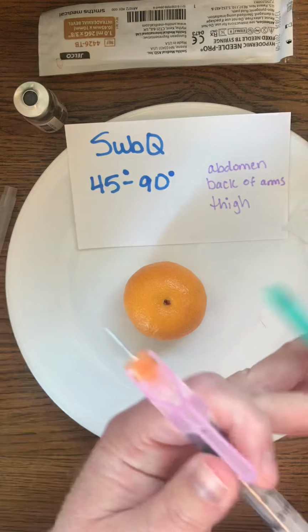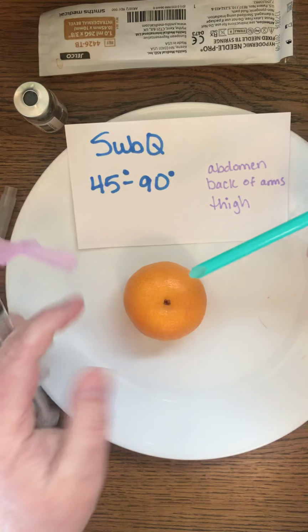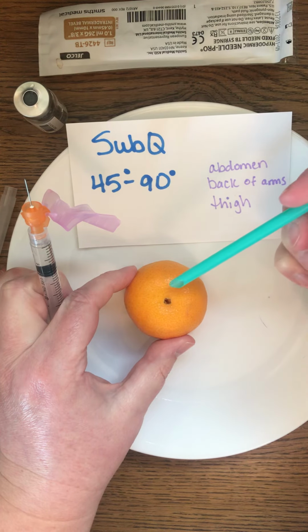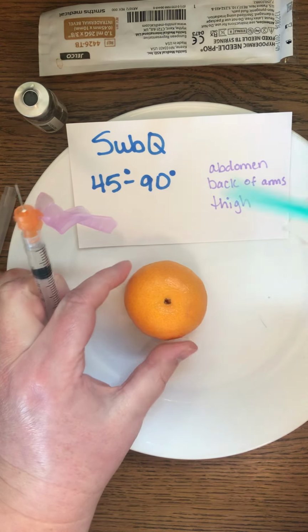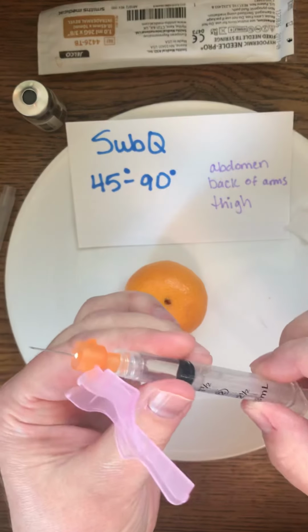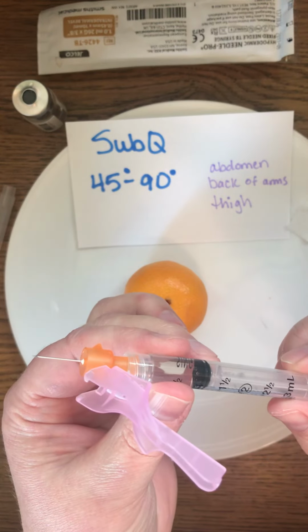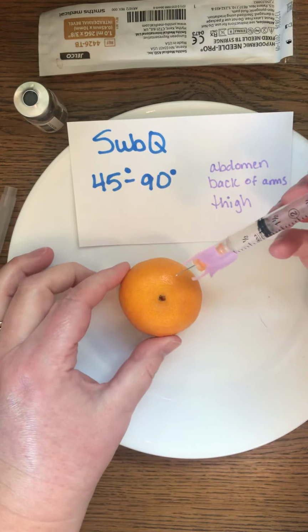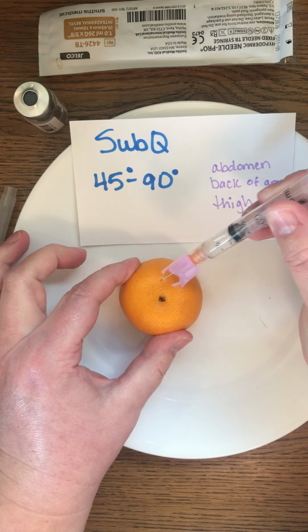So again, to give you an idea of how I'm holding this, I'm going to hold it like this, so you can see my bevel there. So then that part goes into the skin first and pierces the skin. When you're doing a 90-degree angle, it doesn't matter as much, but with this 45, it will. Okay, so once you're ready, you want to hold the skin taut, and you're just going to do a poke in.